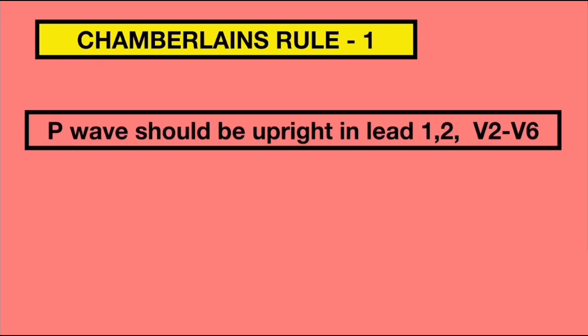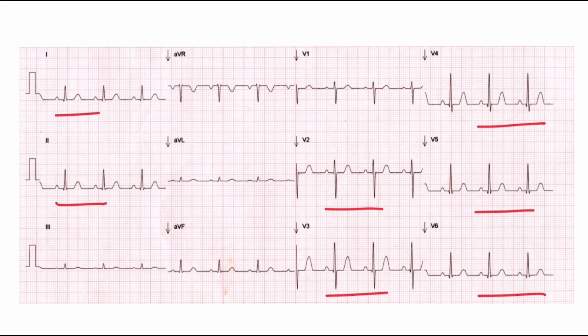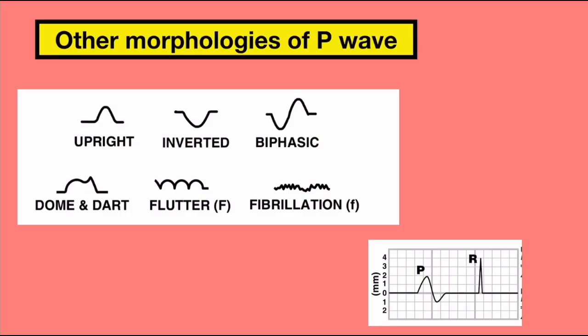Rule 1 states that the P wave should be upright in leads 1, 2, and V2 to V6. In the ECG, we can see that all P waves are upright in these leads. You should also learn that there are other morphologies of P wave which can be seen as abnormal findings in these leads, such as inverted, biphasic, dome and dart, flutter, and fibrillary waves.